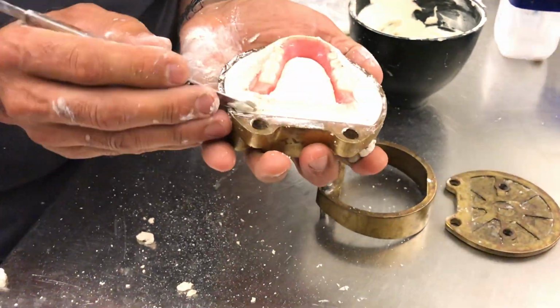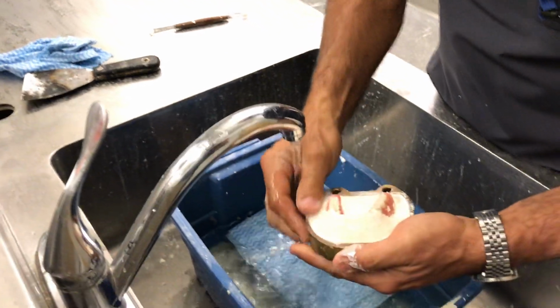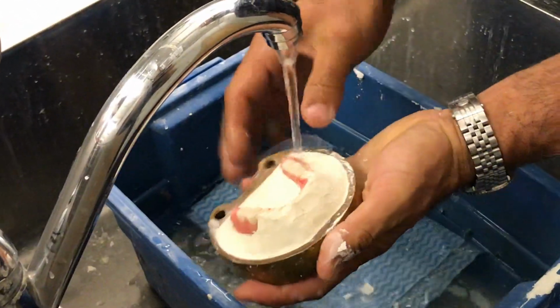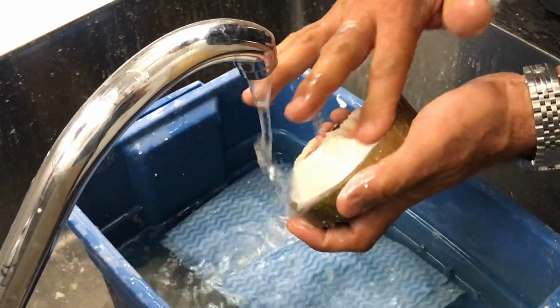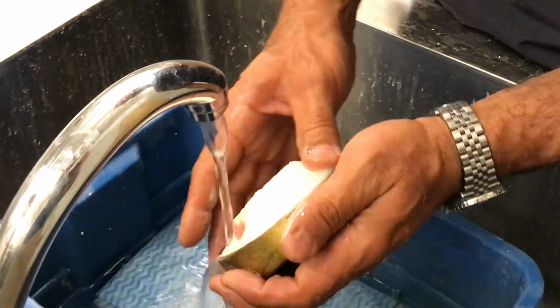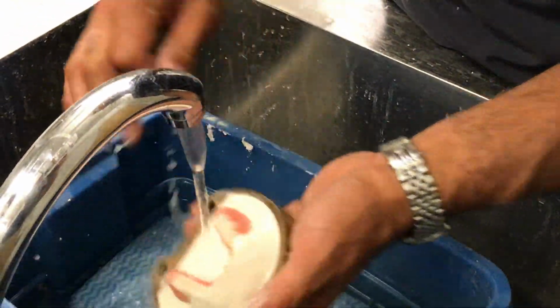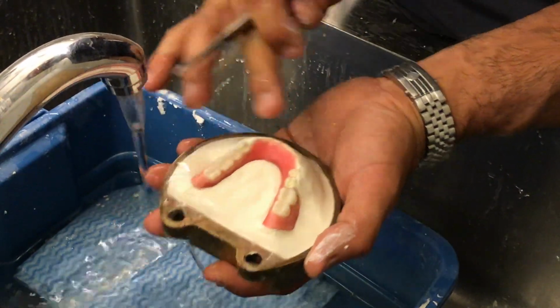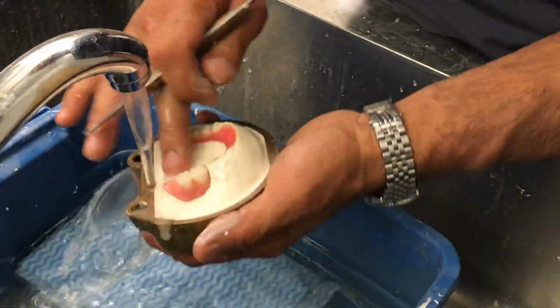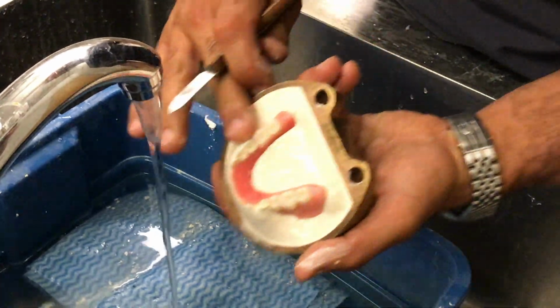Okay, now we're going to go over to the sink and smooth out our investment. Again, we're going to clean off the ledge here so it's free of any plaster stone mix. I've had better timing with this one, so it's a little harder for me to smooth out. Just gently go over it with your fingertip. Clean off some of the flash here. Get in there as much as you can. It doesn't have to be all the way, but at least if we can get a smooth finish for most of the investment would be ideal.